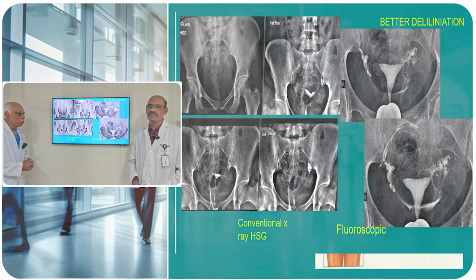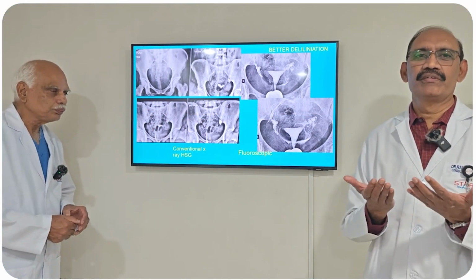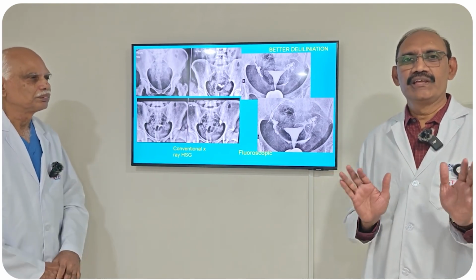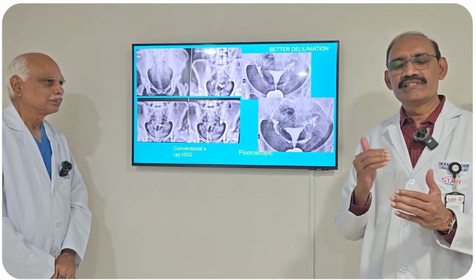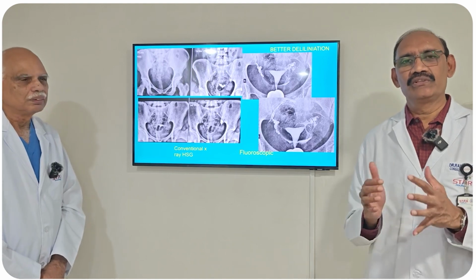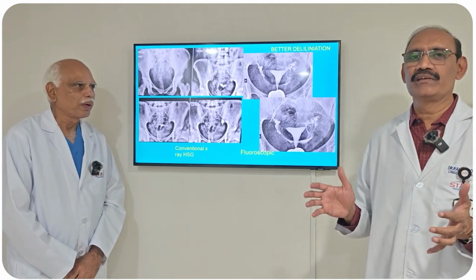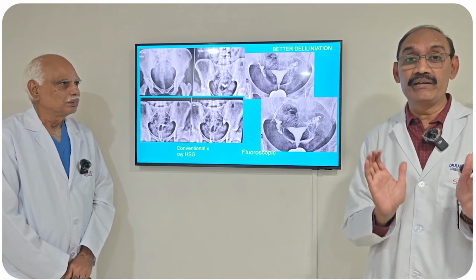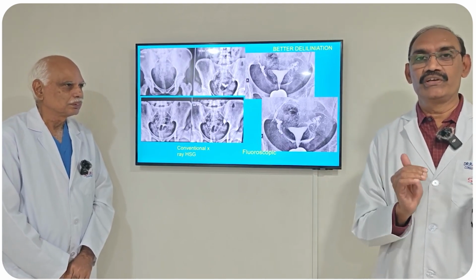In a simplified way, if you look at a photo, we see what that person looks like. If you see a movie, we see what is actually happening, how everything moves. Similarly, this is a static image where we don't know, it's a blind procedure. We don't know what we are dealing with.